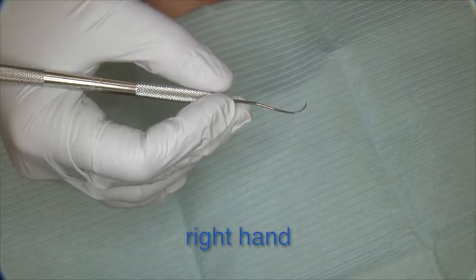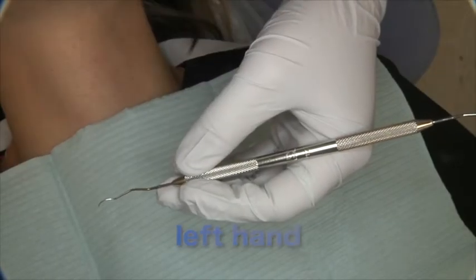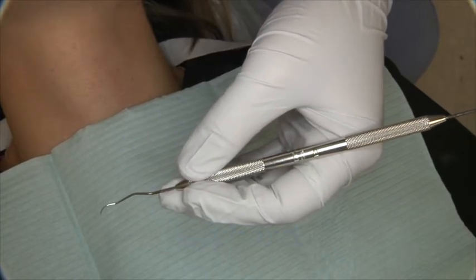Grasp the instrument lightly using a modified pen grasp. Fingers should be slightly curved and relaxed. The grip on the instrument should be light.